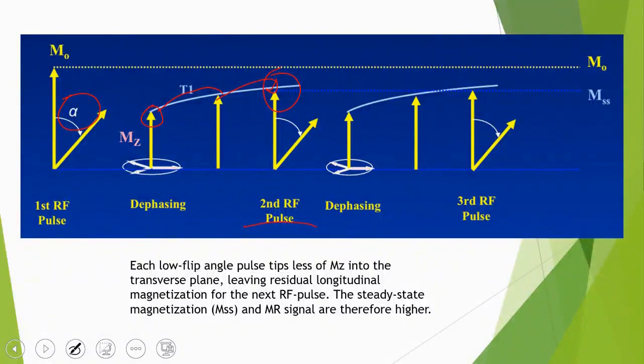What I want to say is that we will use this in angiography. How exactly? You ultimately want to achieve your goal of successfully reaching a steady state. I want to effectively use a small flip angle and a gradient to conduct a quick examination to image the arteries and make them bright. So, do I want to make the signal of the arteries higher or lower than the surrounding tissues? Higher? Great. So what should I do to make the signal of the tissues surrounding the arteries lower?